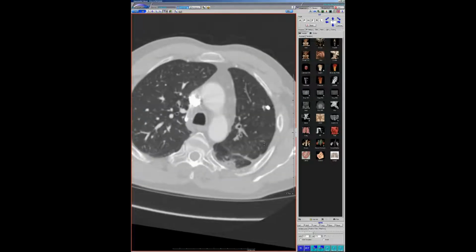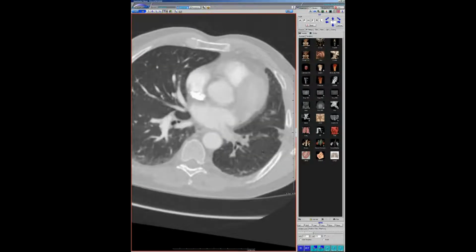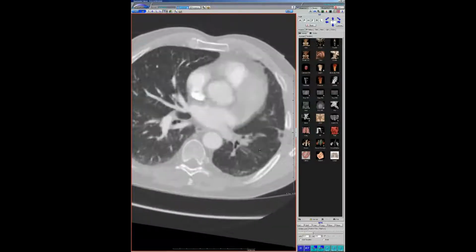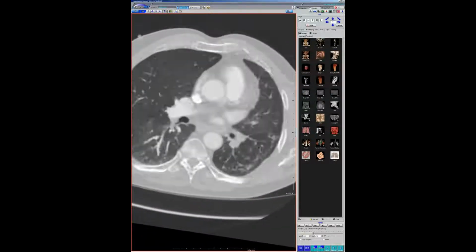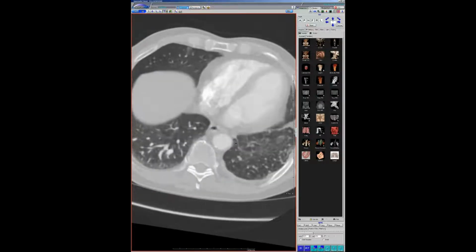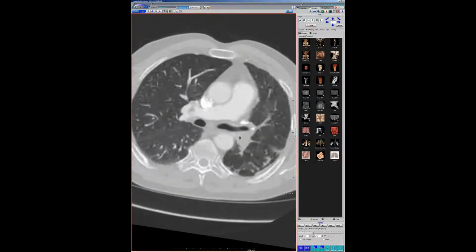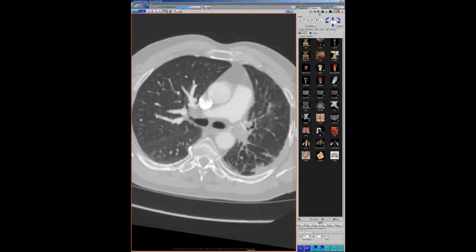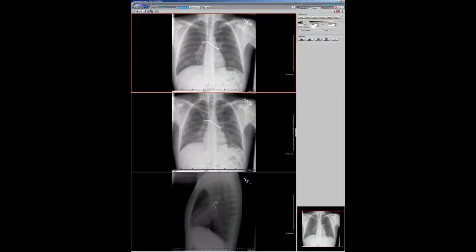And you can see that finding we see peripherally with the fibrosis. The question is, and I don't know if anyone's ever answered it, is it due to the bronchial artery supply, the systemic supply, causing the injury? Is it due to chronic ischemia and causing the fibrosis? Nonetheless, I'm telling you, I've seen it happen before. Surgeons get very, very angry if they go in there for this, because people die from it if they try to remove that stuff. It's like cement.